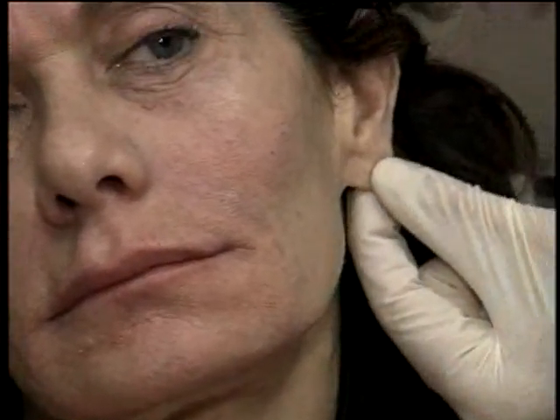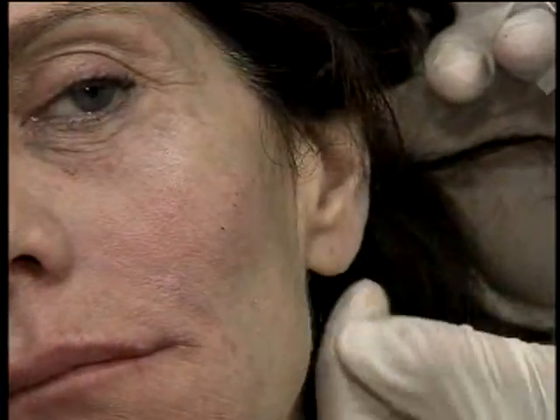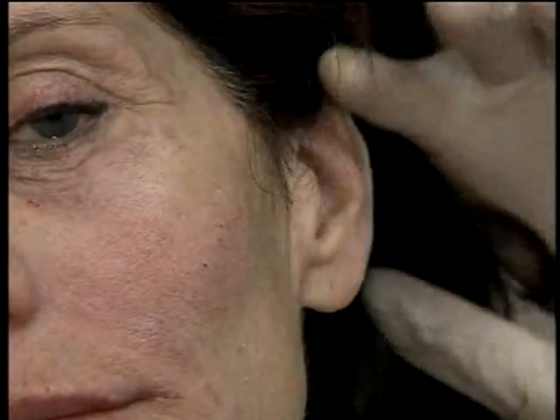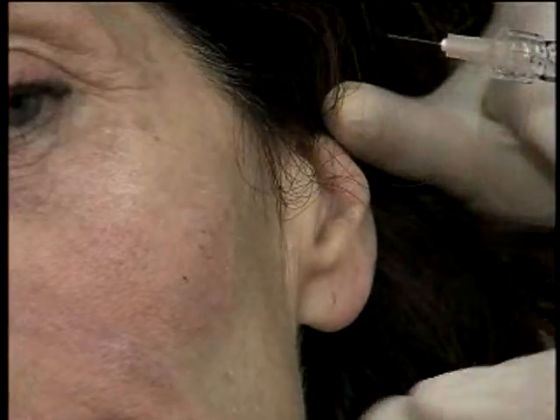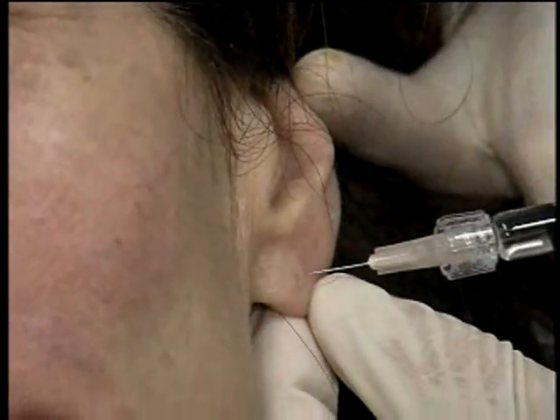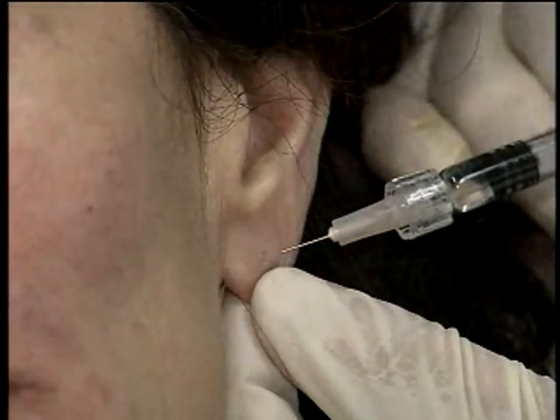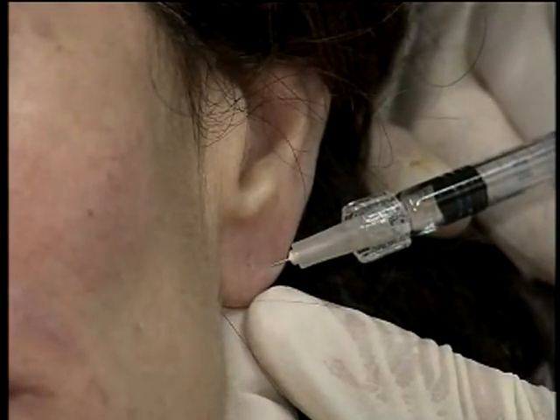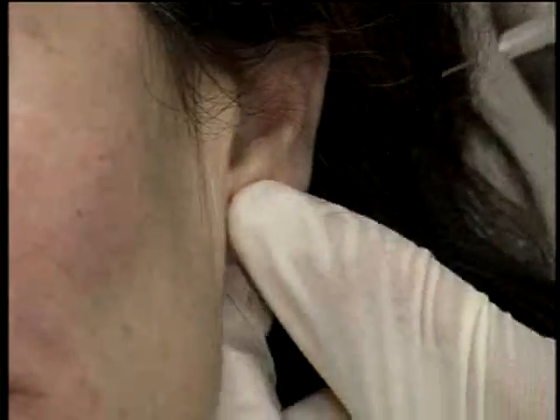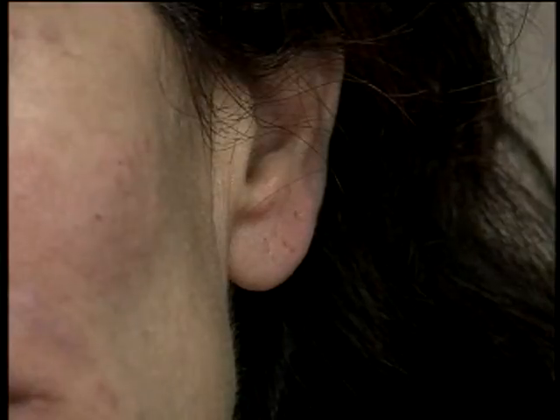One area that recently we've started treating that's been popular is the earlobe. If you decide to treat the earlobe, for someone who's got an aging earlobe that starts to hang, sometimes there's creases in the earlobe, and it's much more dependent. You can place a little Restylane in there. She's not someone who particularly needs it, but for demonstration purposes, I just place it right into the soft tissue of the ear. And some women tend to like the way that looks. They think that their earrings are demonstrated better after filling this in. So I just place a little bit in there and just massage it into place, and it thickens up the earlobe, allows the earring to hang a little bit nicer.